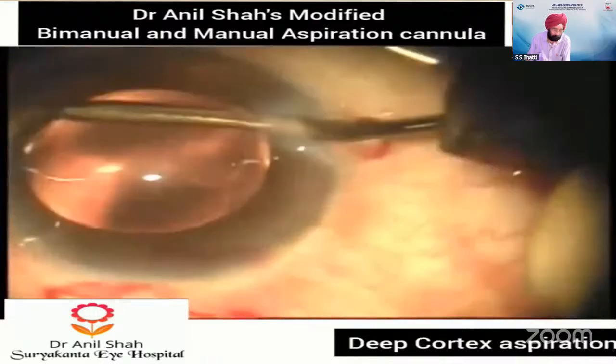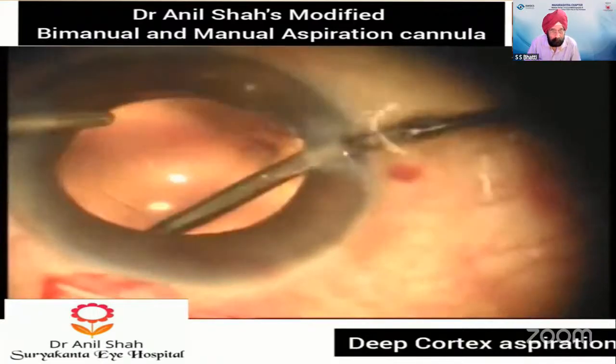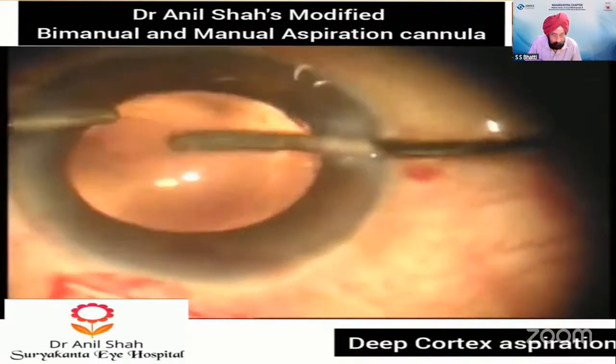Now with this same cannula, you can go deep into the fornices and polish the anterior capsule or posterior capsule and do a complete cleanup.